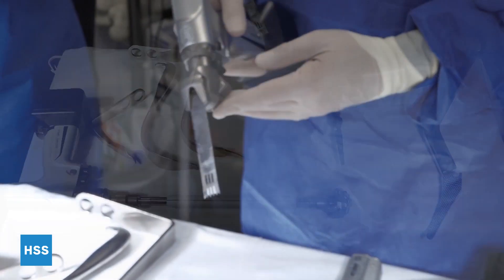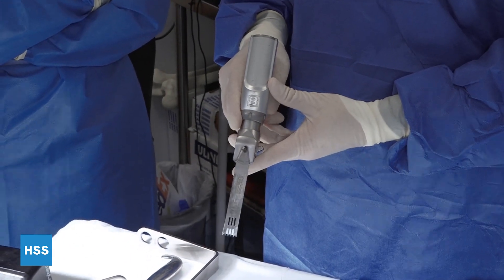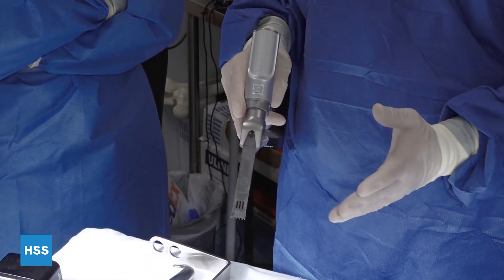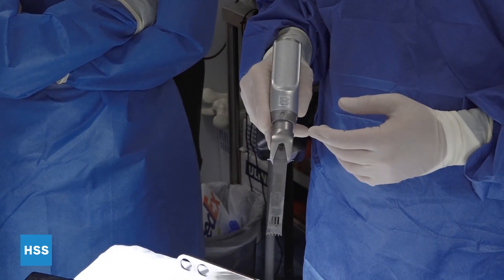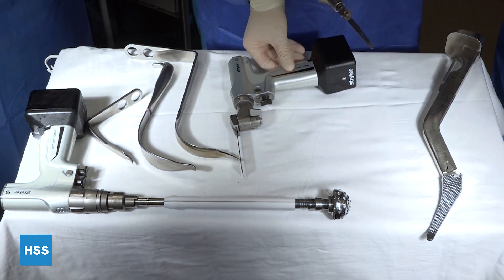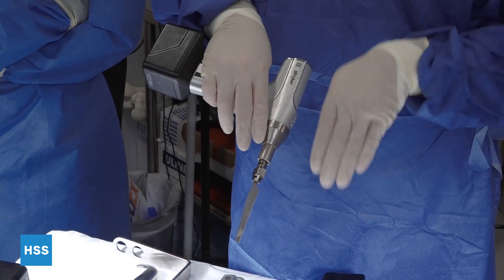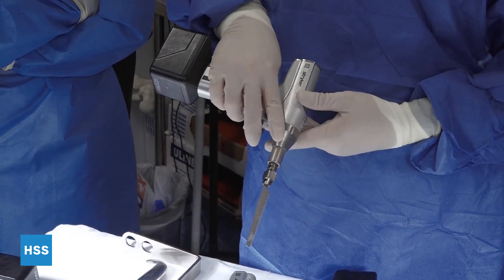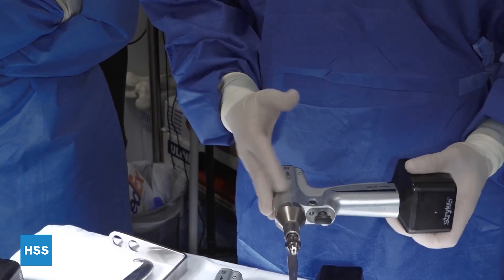Saws — this is called a sagittal saw, it goes side to side. A number of different blades we use for hip and knee replacements. In this case, we would use this blade for the neck cut of a hip replacement. Another option that many surgeons use is a reciprocating saw, so it goes up and down. In this case, it has cutting teeth only on one edge. Also used for the neck cut.